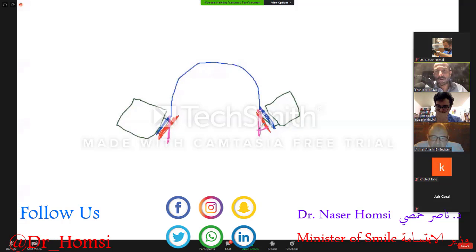So the angle of left and angle of right are exactly the same. This is quite an easy way to check the transpalatal bar activation. This is a first idea. And then, as the colleague said, it is indicated to insert some expansion force, but it's quite easy to do. So the molar will tend to derotate and to go in a backward direction.